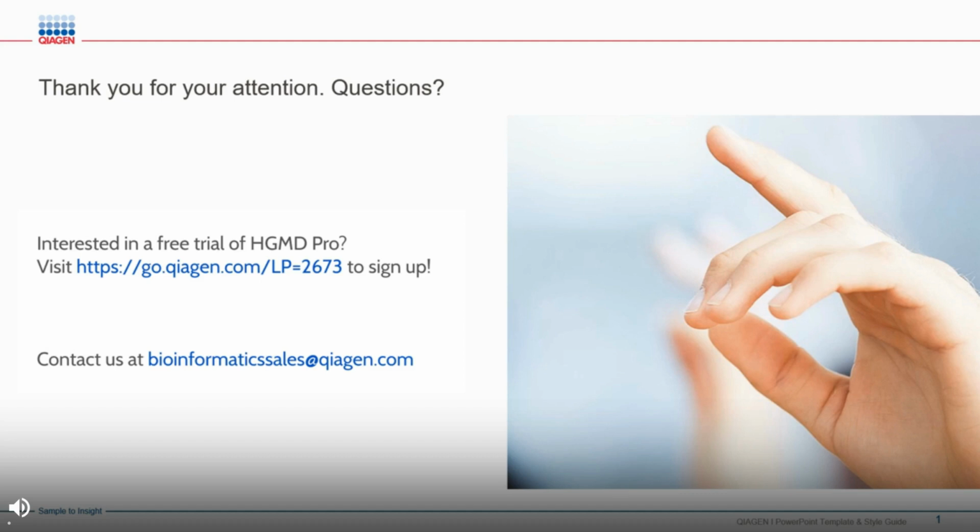Great. Should we be refreshing VCFs uploaded from HGMD to UCSC every quarter? Yes, so every quarter when the new version of HGMD Professional comes out, there will be substantial additions and new mutations that are added to the database. So I think it would be a good idea to upload the new VCF each quarter, just so that you're reflecting those new additions to HGMD.